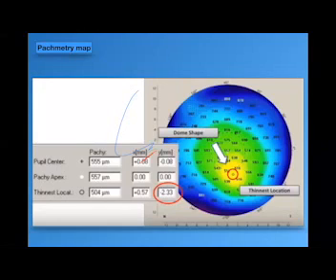You have to correlate the thickness on the back of the cornea. The difference between the superior and the inferior points of the cornea shouldn't exceed the accepted range, which is from 30 to 35 micrometer. If you find a thinning in the inferior cornea which is far away from the superior part of the cornea, you have to suspect it, even if it's still in the normal range.